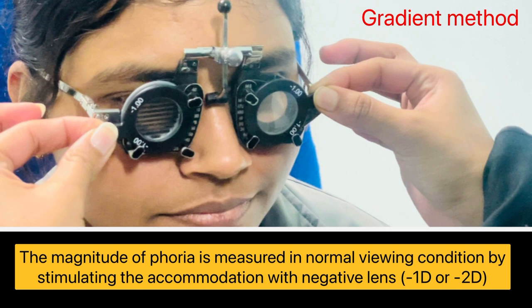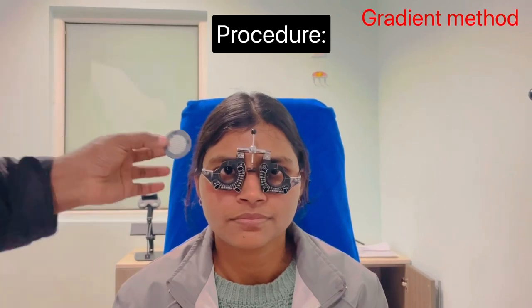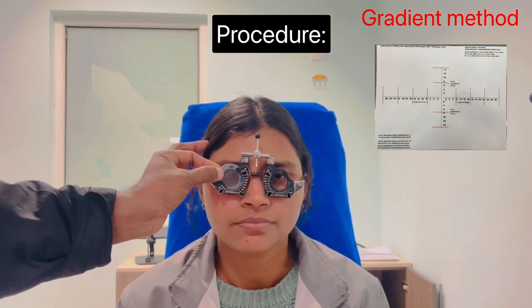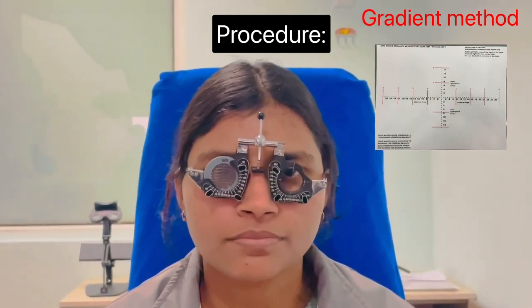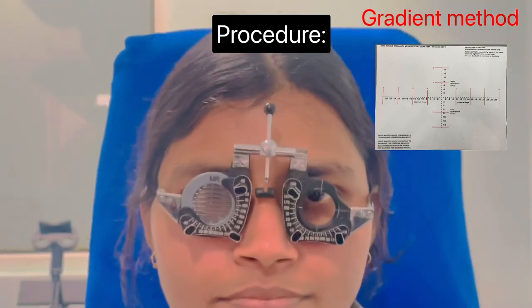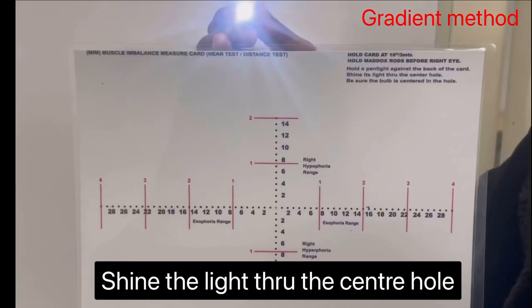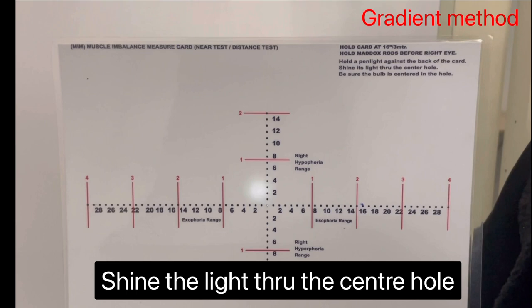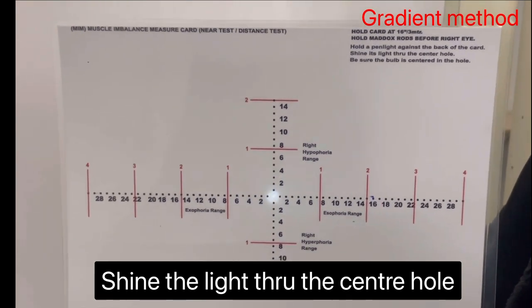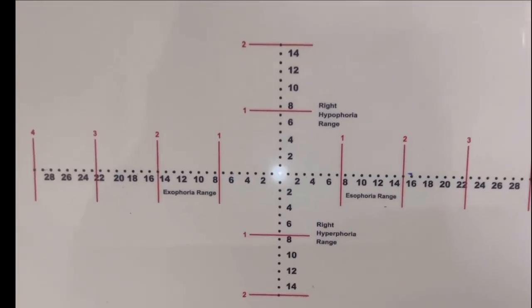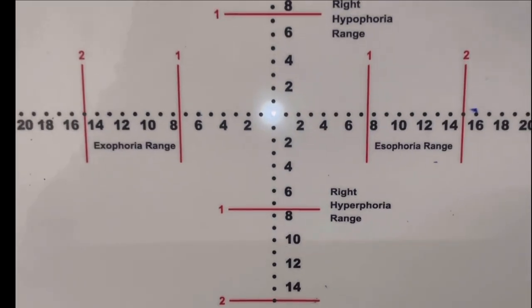Through gradient method, we can measure phoria in normal viewing condition by stimulating the accommodation with negative lens, either with minus one or minus two diopters. To perform this test, place the Maddox rod on a trial frame and ask the patient to look straight at the center of the modified Thorrington chart which is kept at 40 cm. The chart should be illuminated through the center and patient should be asked to look at the light.